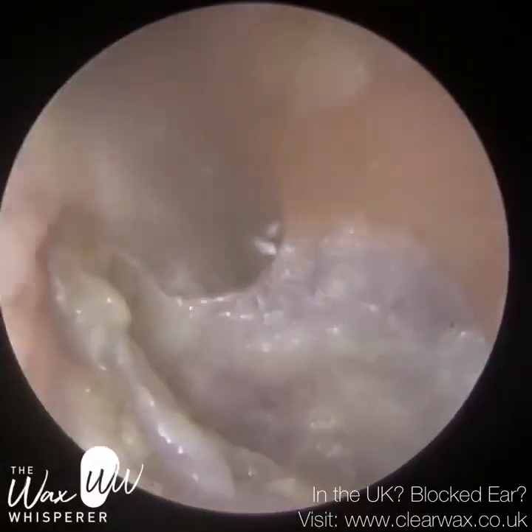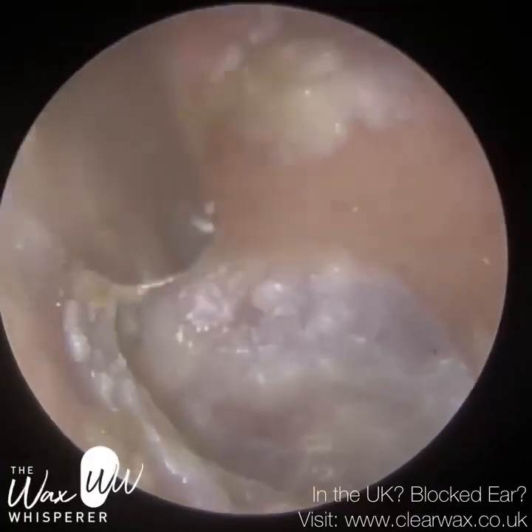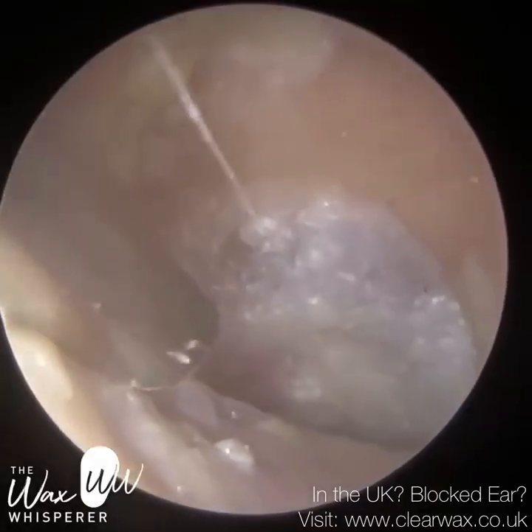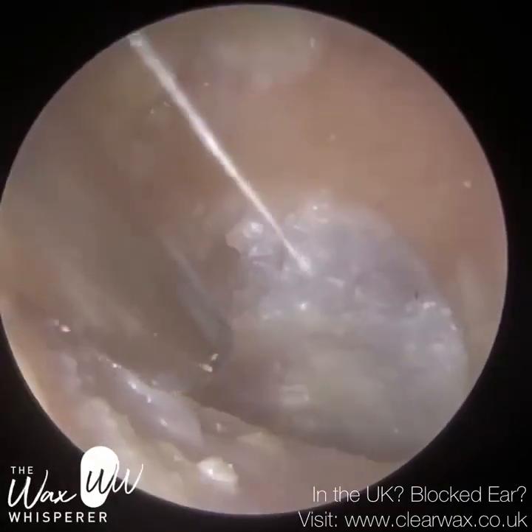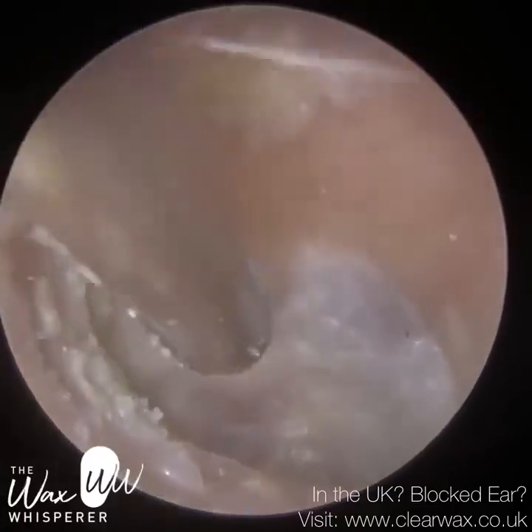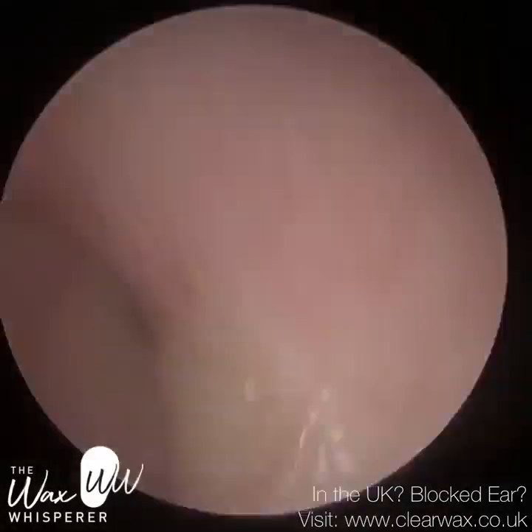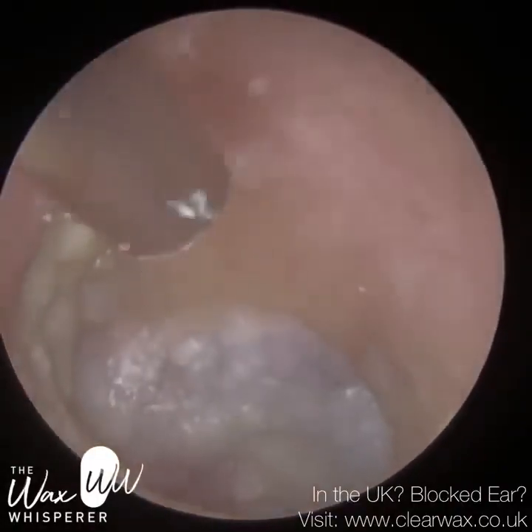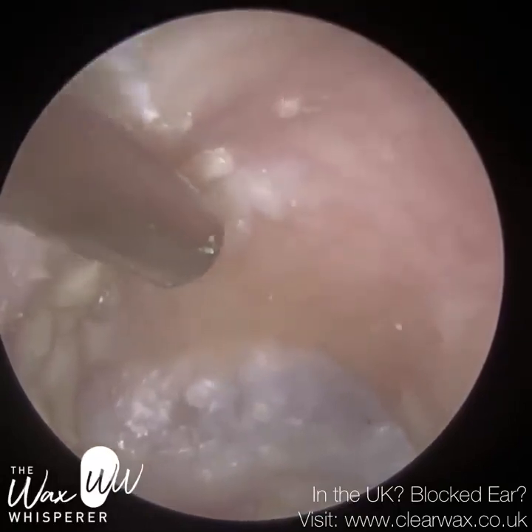They have got some debris at the top of the ear canal and also some in the anterior recess. This patient has got quite a bendy, twisty ear canal, and they've got a prominent anterior recess. So what's the anterior recess? As we approach the eardrum, the ear canal narrows and then it widens again, and it normally widens on the front section of the ear canal, so we call that the anterior canal wall, and at the floor of the ear canal, the inferior canal wall. When the ear canal widens, you get these two recesses, the inferior recess, which is like a trench at the bottom of the eardrum, and an anterior recess.